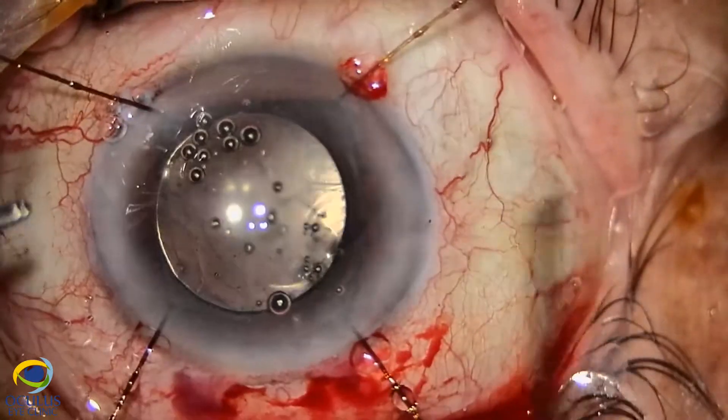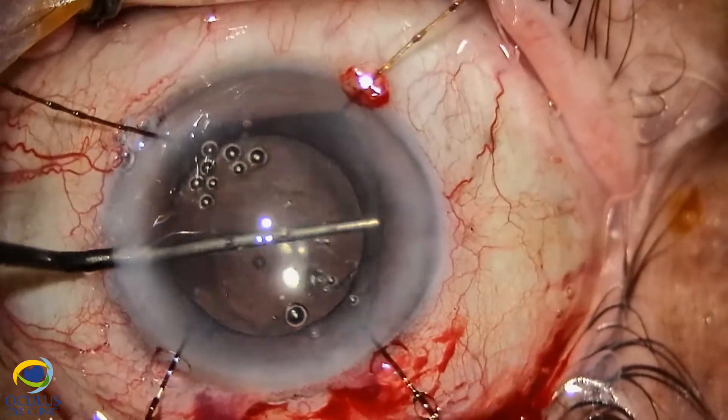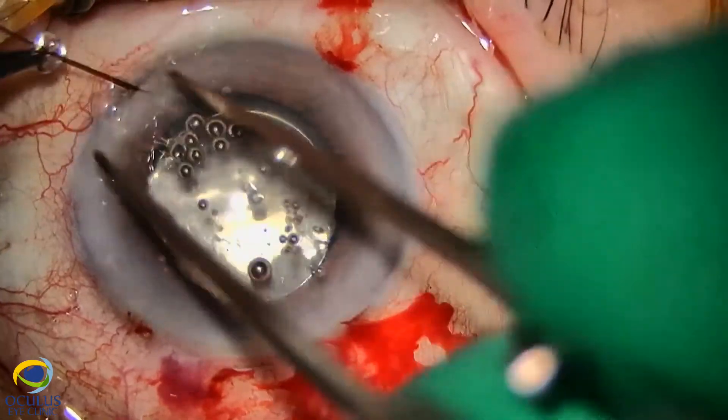So despite the larger incision, the implantation is much safer. We checked again that the haptics lie very well on this large capsulorhexis.